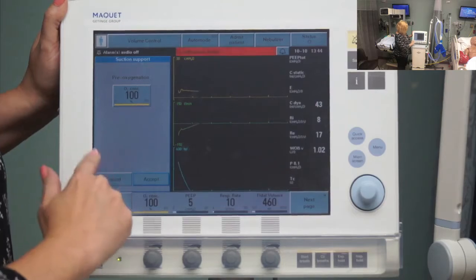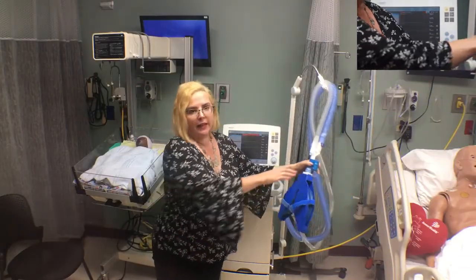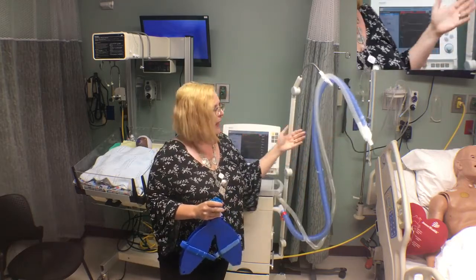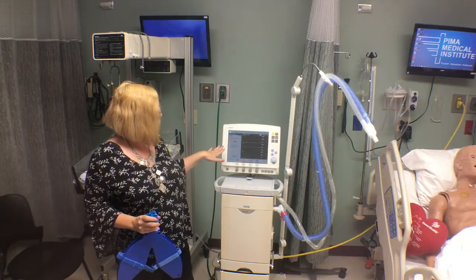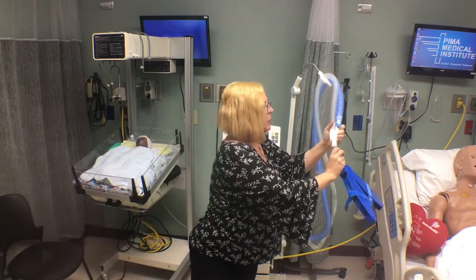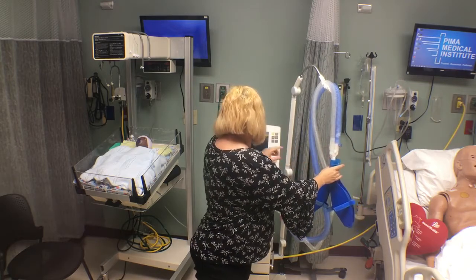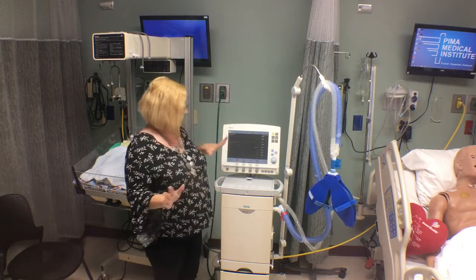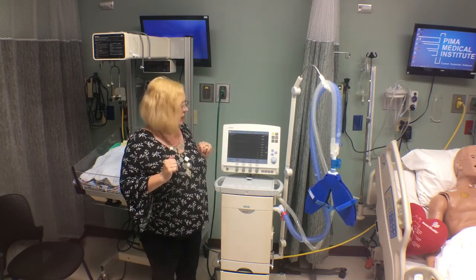The nice thing about suction support is this is when, if you're going to disconnect the patient from the ventilator in order to open suction, or maybe you have to move the circuit around, something like that, it's not going to alarm. It's going to pre-oxygenate with 100% oxygen, and then it'll let you move everything around, and then you can put this back on, reconnect it, and it gave me an alarm, but it went ahead and went right back into ventilating the patient.